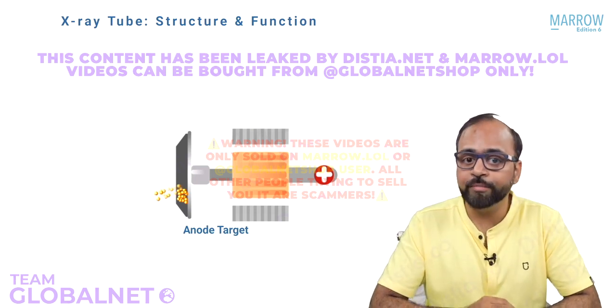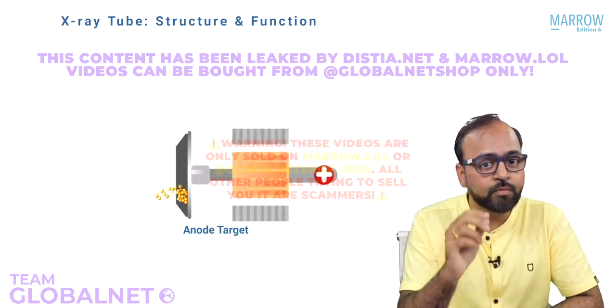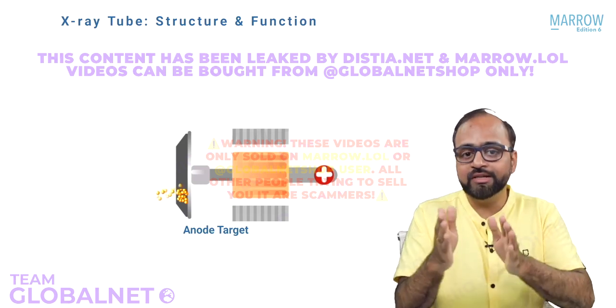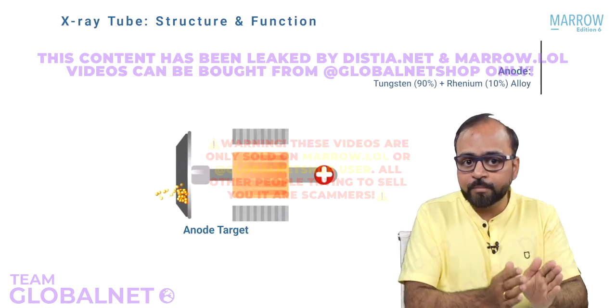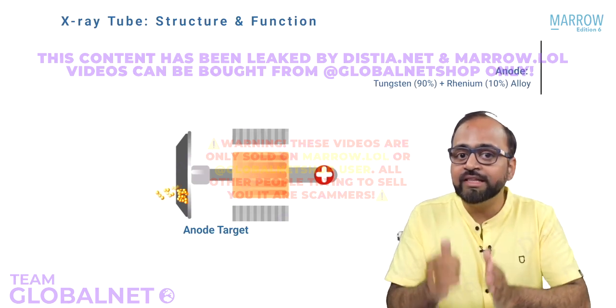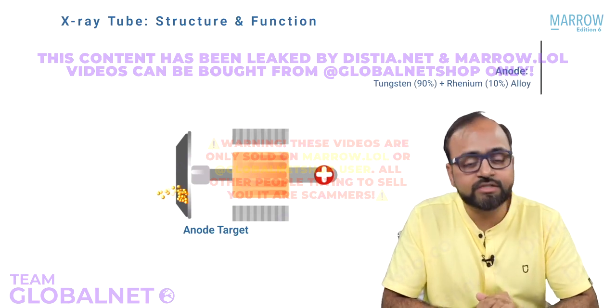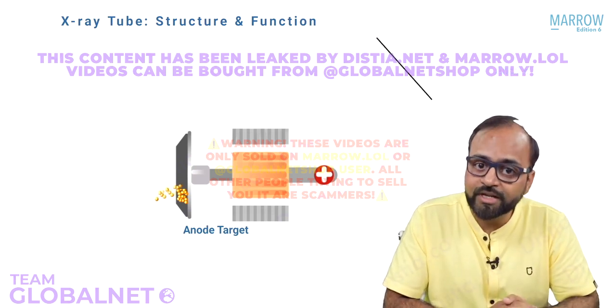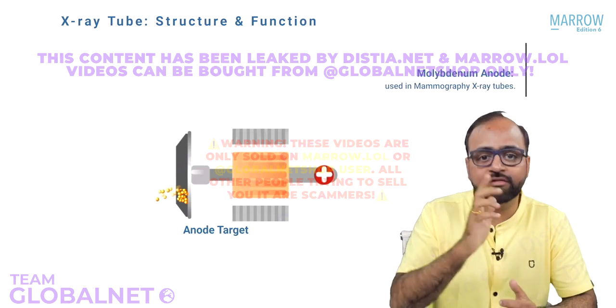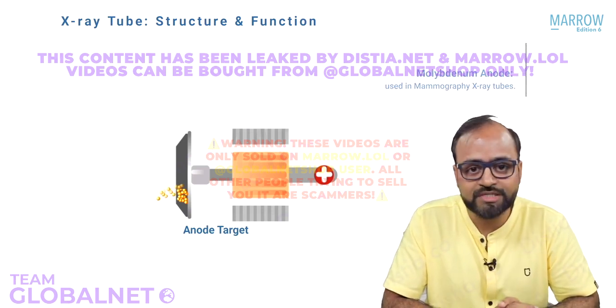What is the anode made up of in an X-ray tube? The anode most commonly used in an X-ray tube today is an alloy of tungsten comprising 90% of it and rhenium comprising 10% of it. This is the most commonly used anode material. In certain X-ray tubes, molybdenum is also used, especially in mammography X-ray tubes. Molybdenum is used as the anode material.